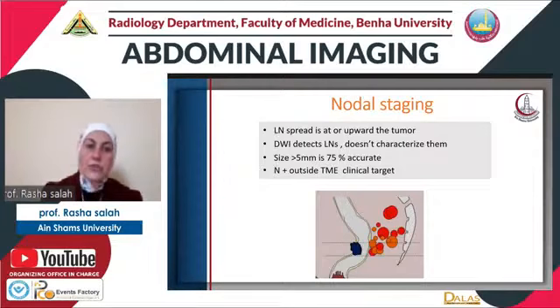We classify the lymph node assessment into regional lymph nodes with two groups, either perirectal lymph nodes or the extramesorectal lymph nodes located at the obturator or internal iliac groups.